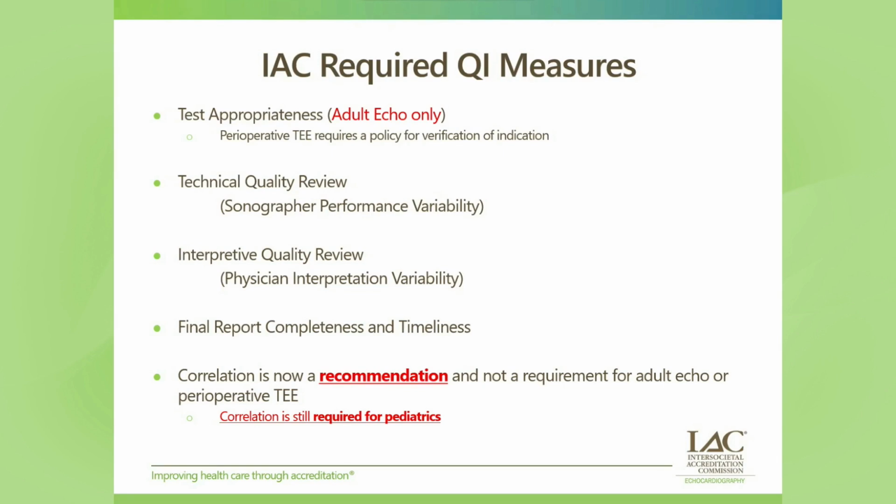I want everybody to keep in mind that during a TEE, whether this is adult, pediatric, or perioperative TEE, the sonographer in this case is the physician. So please make sure that you are doing a technical quality review of your TEEs as well.